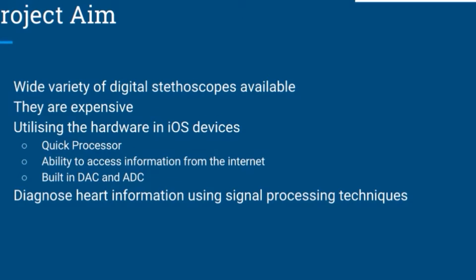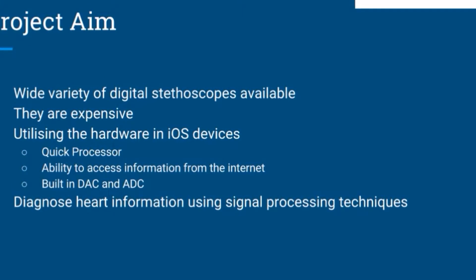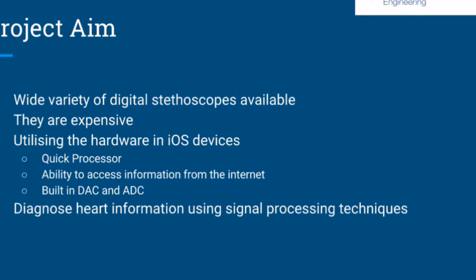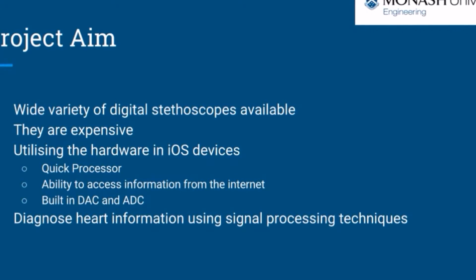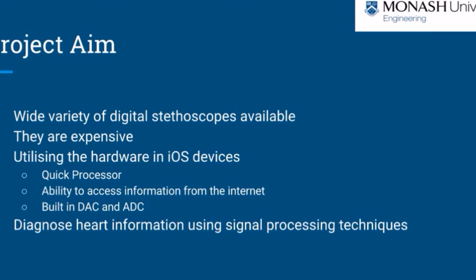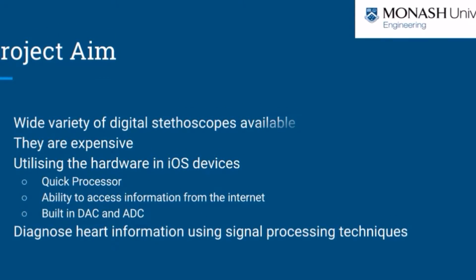For our project aim, there are a multitude of digital stethoscopes available on the market. However, their dedicated hardware and software make them very costly. So, by utilizing an iPhone's quick processor and ability to access information from the internet, while also having a built-in DAC and ADC, this project aims to provide an inexpensive alternative to save and record heartbeats, while using signal processing techniques to output heartbeat information from heart rate to heart disease symptoms.